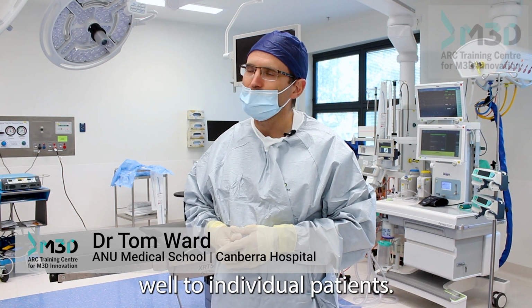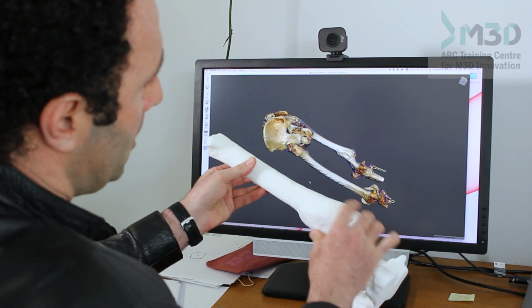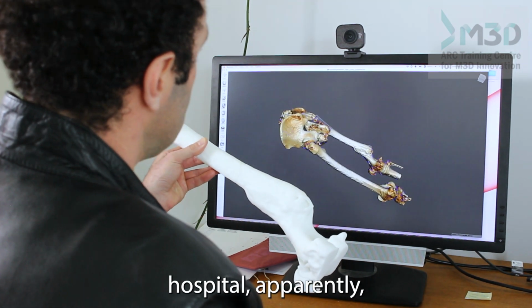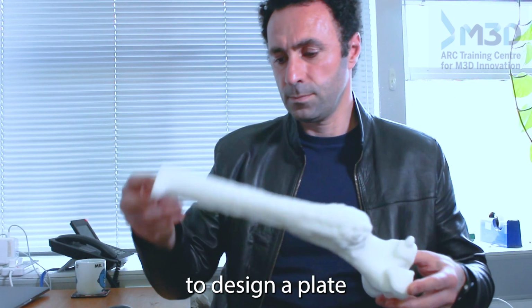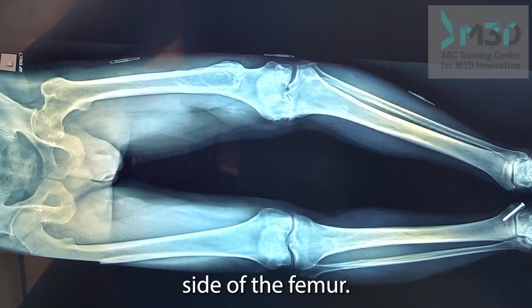to individual patients. We decided that the best way to do it, instead of talking all the time, was to do a process from start to end for a patient. So we received a patient's CT scan with a fairly severe femur trauma that was there for decades. Never set properly. He had an injury when he was a teenager, and he went to the hospital apparently, and they told him, look, just go home and rest until it's fixed. But the trauma was too severe to be able to design a plate that could be optimized for the patient's bone anatomy. But we also had access to the CT scan of the healthy side of the femur.